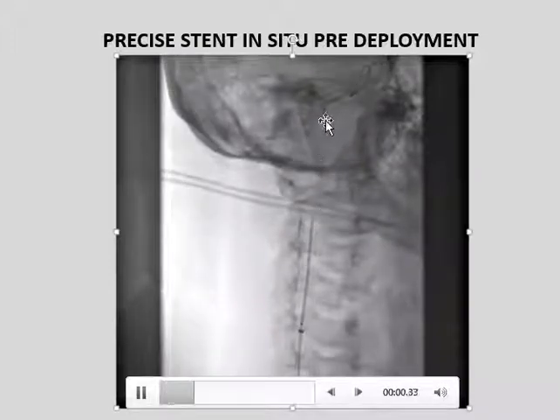And here you see that extension, that wire, with a little basket at the end. And that, although you can't see it, would capture any embolic debris that would flow distally to the upper regions of the brain from the carotid trunk.